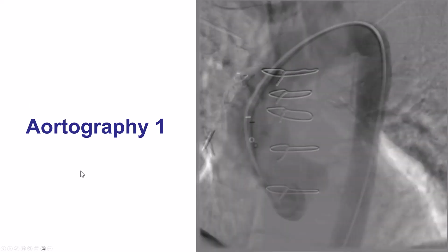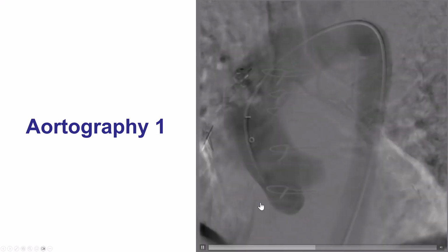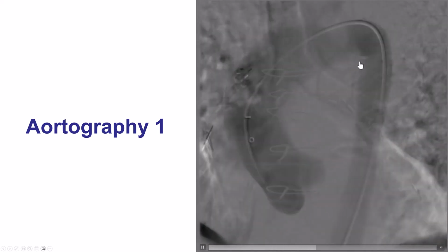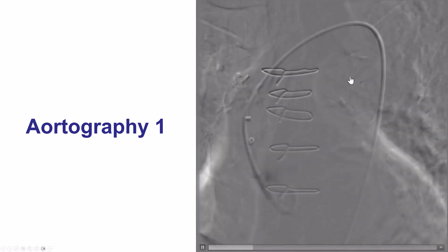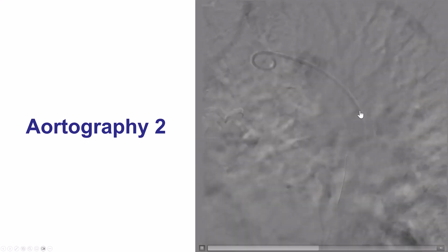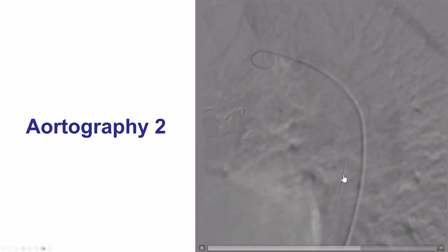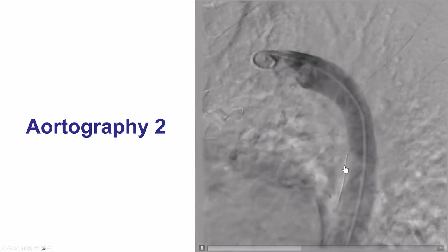The catheter was all the way into the aorta. So we did aortograms. This is starting from the aortic root, and fortunately the ascending aorta looks okay. However, we're starting to see some extra contrast along the side of the descending aorta that is concerning for dissection, which actually was confirmed when we did another picture a little further down. We do have essentially the wire coming from the right femoral access being outside, likely in an area of dissection.